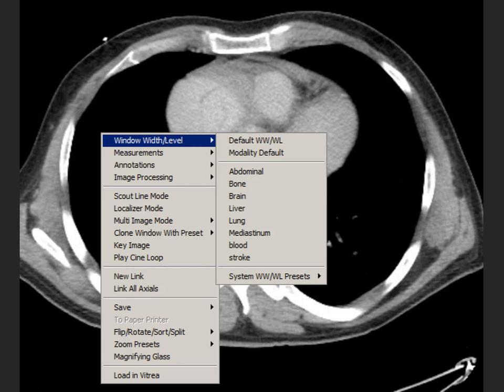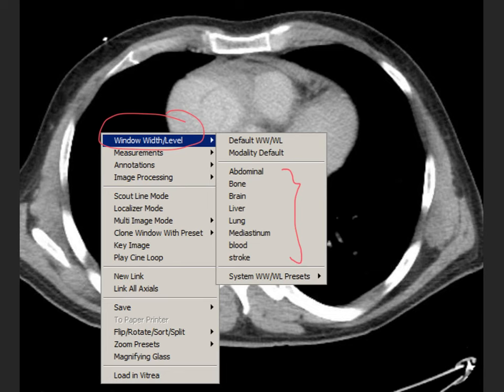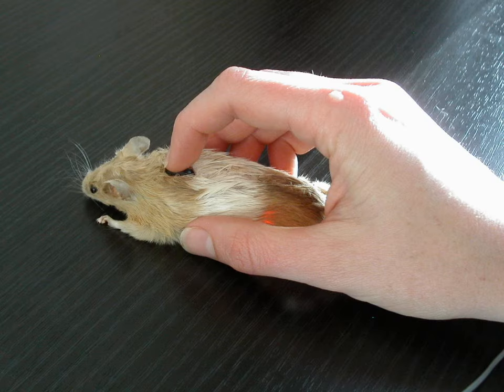Changing between these different windows is very easy. It's usually a right click where you can select window width, measure, and select one of the presets, or it comes off the top toolbar. You may have hotkeys on the keyboard associated with specific windows for the software you're using. Either a left click drag or a right click drag on the mouse, depending on the software, will allow you to make fine window and level adjustments.